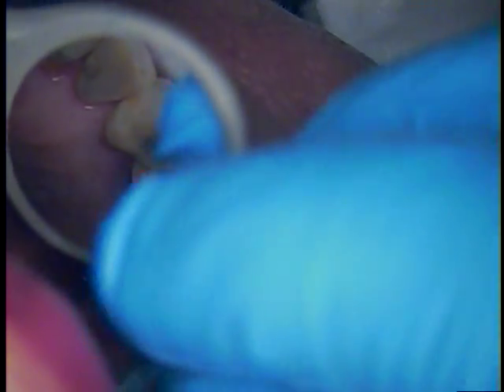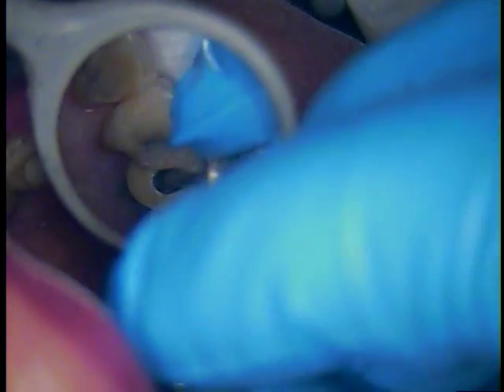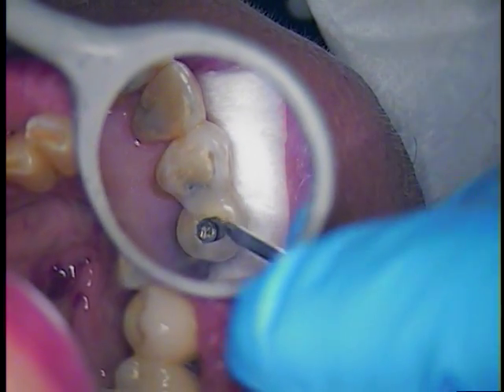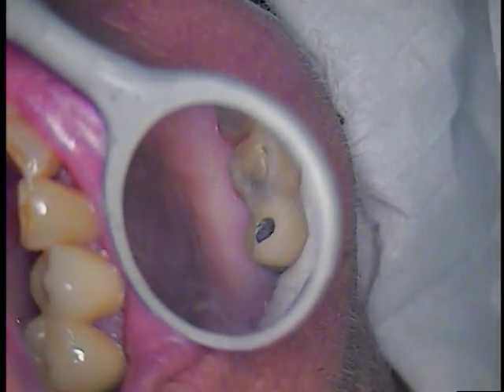You okay? So, we're unscrewing now, gently. The screw is starting to come up. It probably won't come out — the screw probably won't be able to come out — so it's going to reach a limit of headroom in here. Once it does that, we've got to undo the bonding.